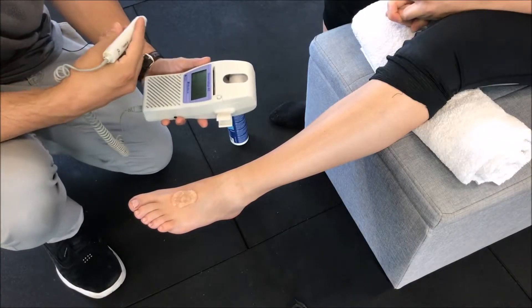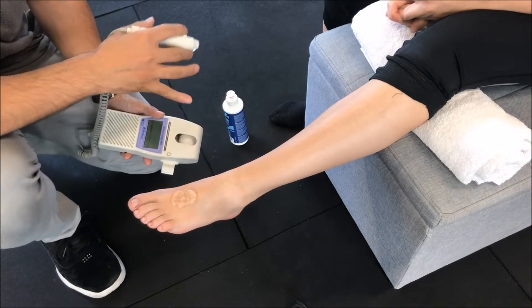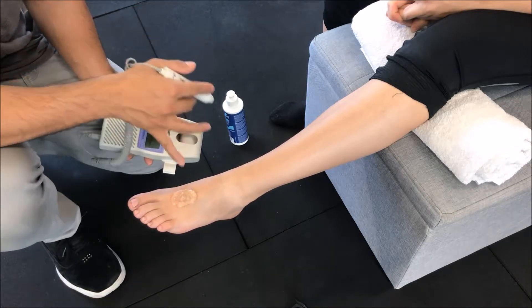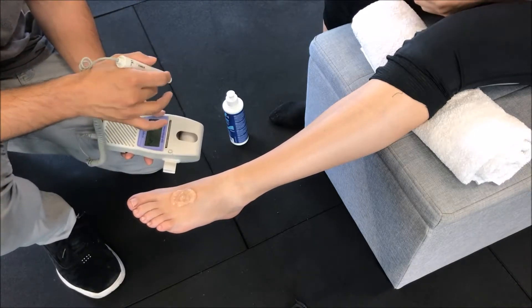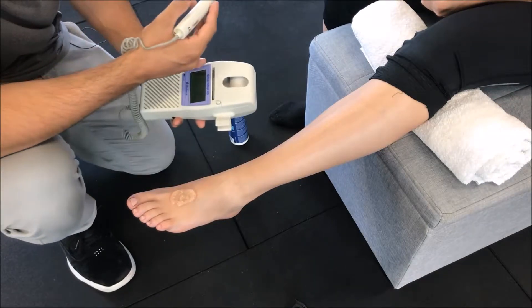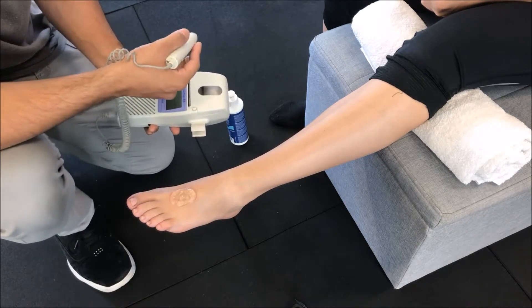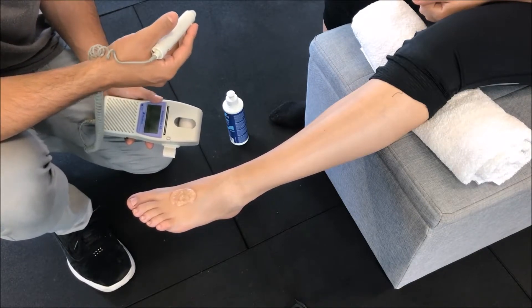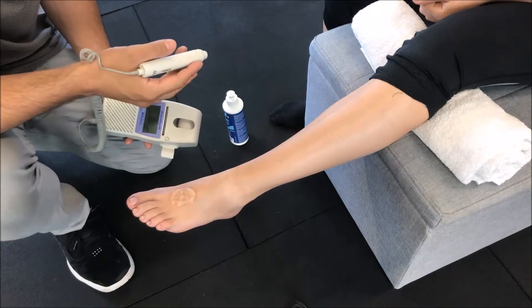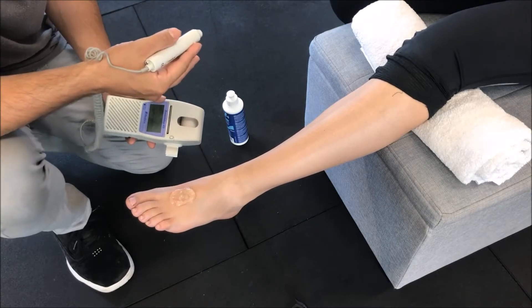In this demonstration, I'll be performing a Doppler ultrasound test on Jess's foot. The purpose of this test is to find the pulse quite far away from the heart — specifically the dorsalis pedis. This test tells us whether someone's pulse this far away is strong or weak, and it gives us an indication of healing ability for diabetics. If the pulse isn't there or isn't strong, we can deduce that healing ability might be poor.